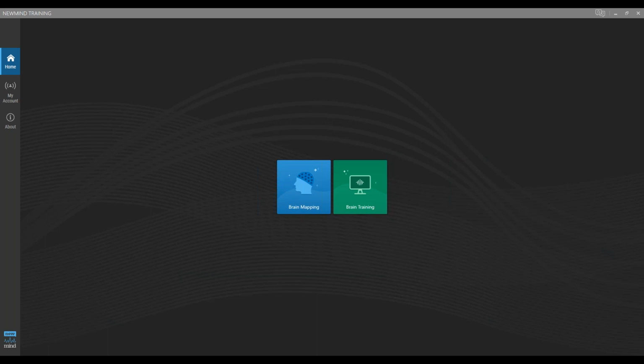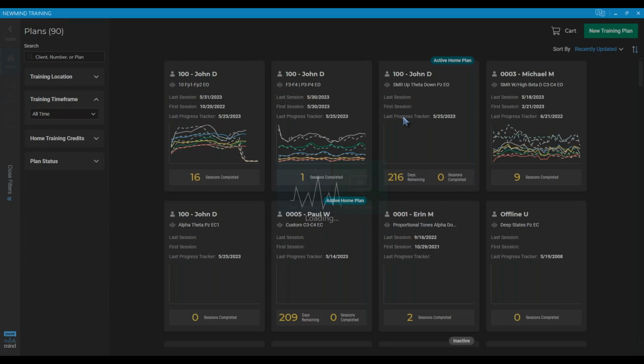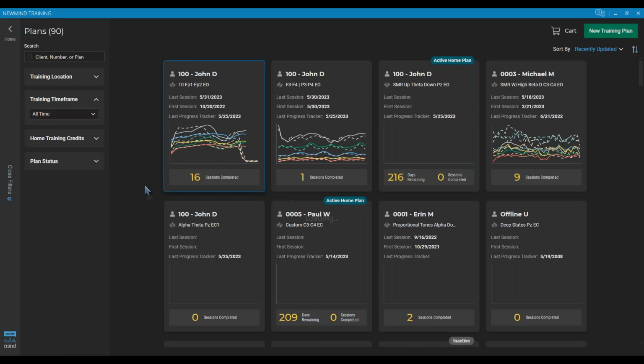They thought it would be really cool if their clients could get a little massage while they were doing neurofeedback, to keep them relaxed, which was a good idea in theory. But in practice, all those little motors humming away were causing massive electrical interference, and the client was actually sitting on top of all those motors.